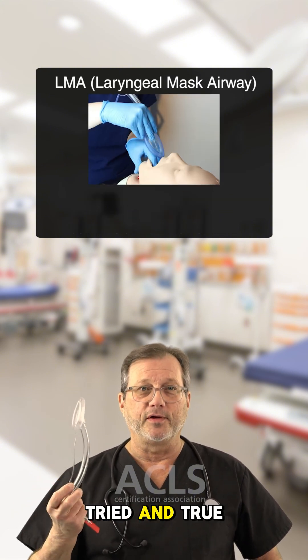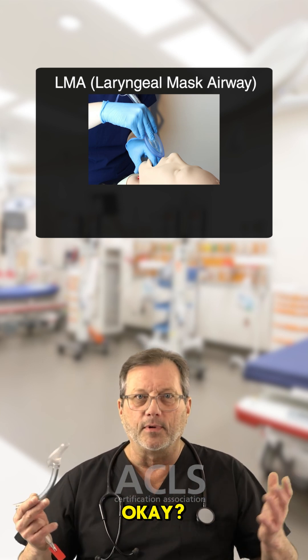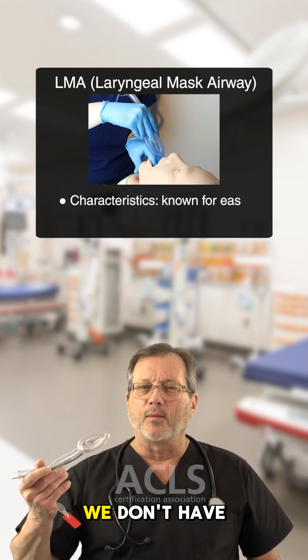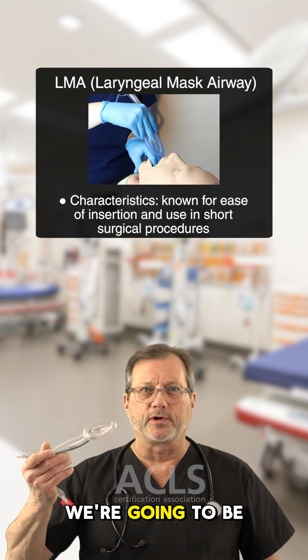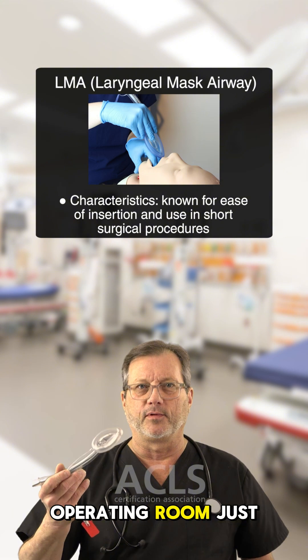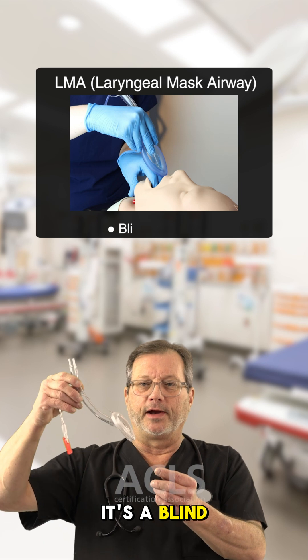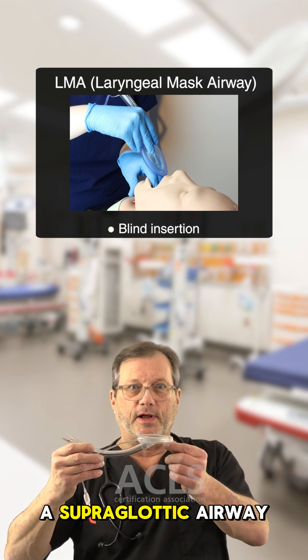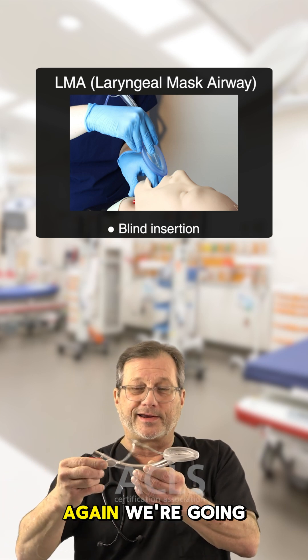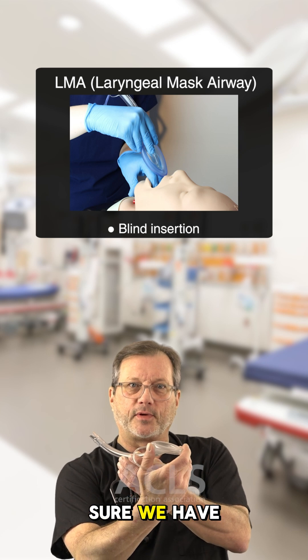Next, the LMA — tried and true. I've only seen these fail in the ER. These are really great in the operating room for quick procedures where we don't have to intubate the patient, and they're used routinely in the OR just for that purpose. The LMA is a blind insertion supraglottic airway designed to fit over the glottic opening. However, once inserted, we're going to need a syringe — we have to fill this cuff up and make sure we have a good seal.